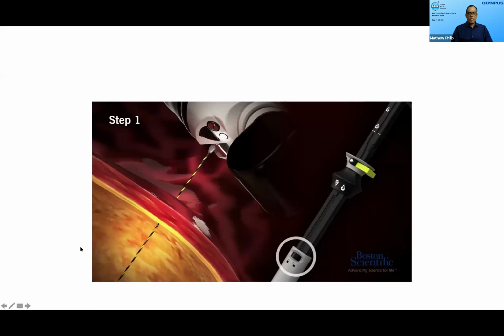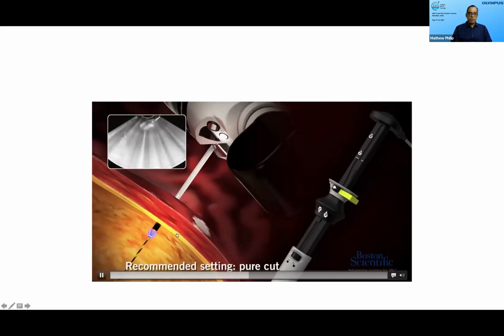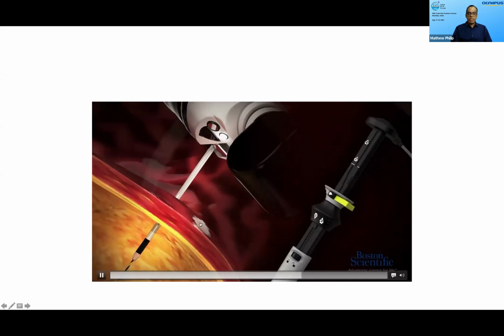It is actually not exactly for GJ. What you see is actually the handle. It is pushed down. You go inside the cautery system. You go inside the bowel. You initially unlocked it. Now it is locked.